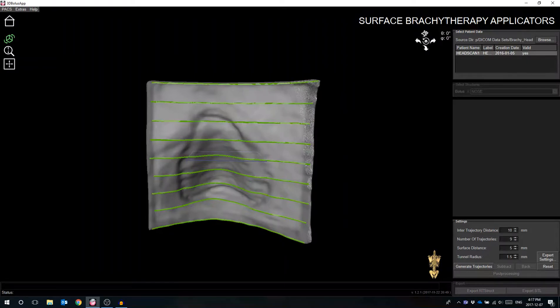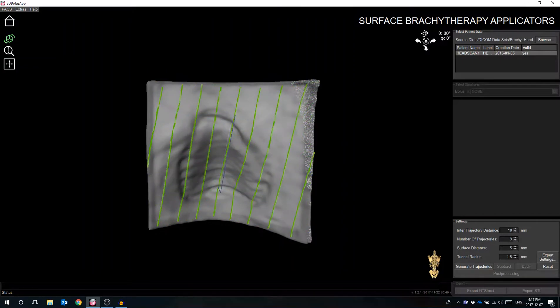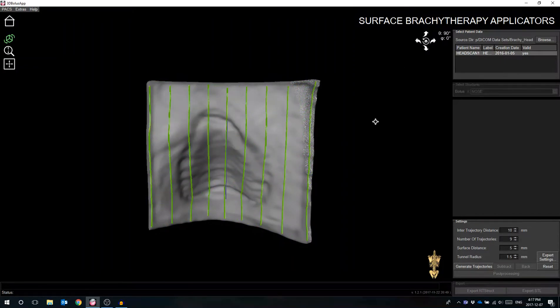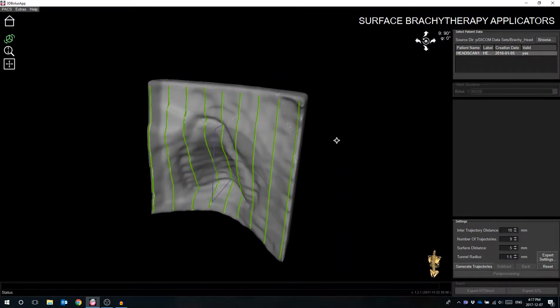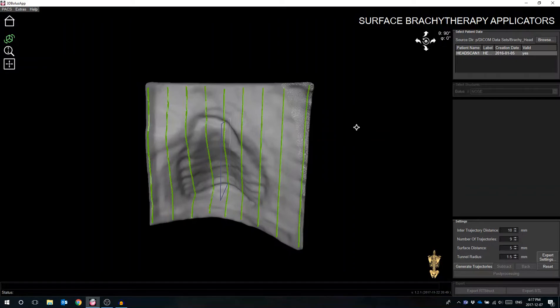By clicking the arrows in the top right corner, the user can change the direction of catheter trajectories. The orientation should be designed such that the minimum curvature is achieved. This will ensure the best probability that the radioactive source does not get jammed within the applicator structure.